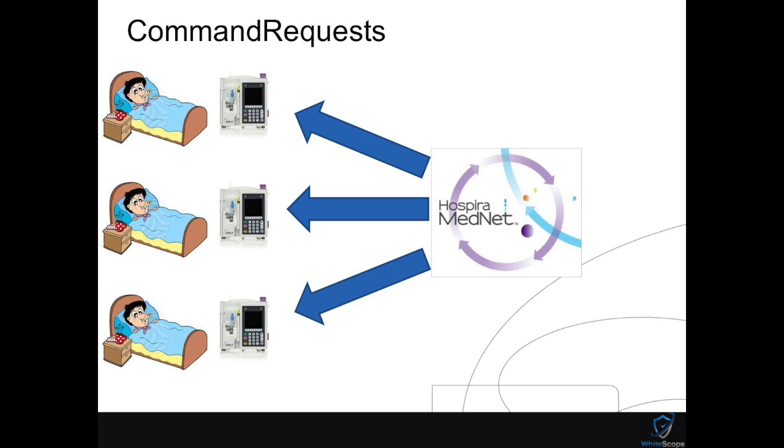I'm going to speed up here and talk about one of the more dangerous things we saw, from an architecture standpoint. If you're creating an IoT device, generally you don't want to do this. For the most part, when we look at IoT or medical devices, where the device acts purely as a client, those are usually pretty challenging devices to hack, because the attack surface is very small. It's got no services listening, so really you're just trying to get access to the transport and then do something from there, or maybe spoof a server and try to convince the device that you're a server and tell it to do something. Usually what you don't want to do is put a server on the device itself. Right, and these devices all have servers on the devices themselves. In fact, that's the way they're designed to work.